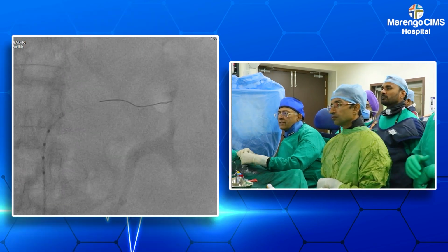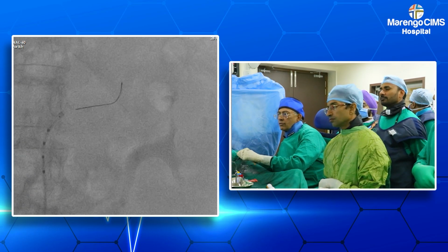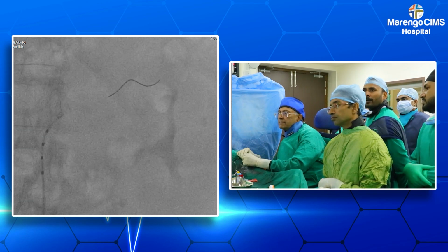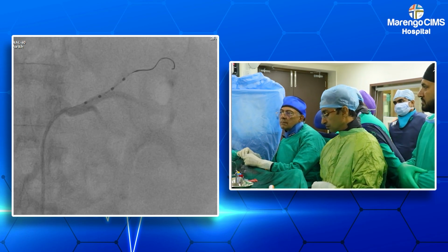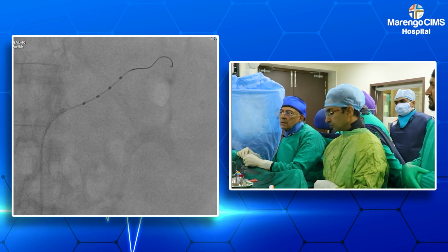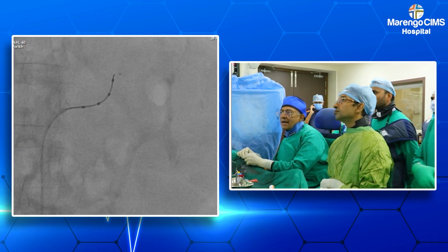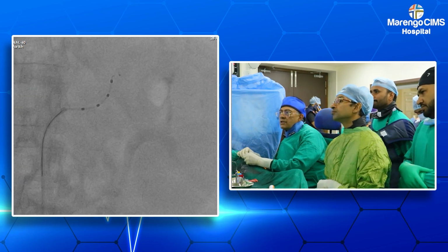So now we'll pull everything out in terms of the wire. First, let me get a good wire, make sure it doesn't get pulled back the catheter. Yeah, so that is what I mean. Yes. That was always the issue. Being a large artery, the angle was not conducive.